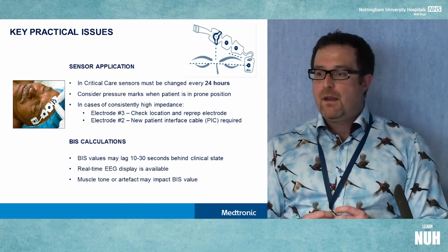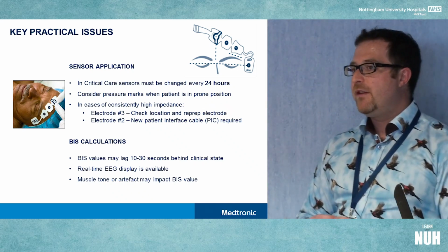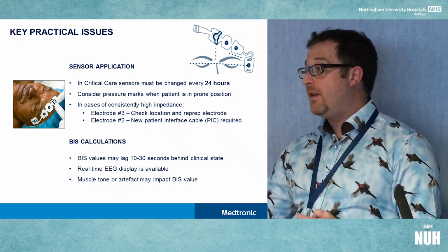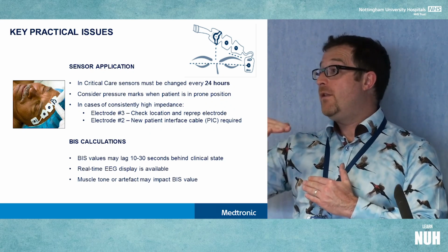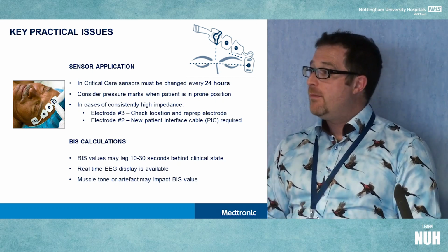So again, high level artifact or muscle tone we're aware of in terms of the fact that it may or may not be clinical. Sometimes we can get this higher level electrical noise that could be diathermy or it could be environmental. It's non-clinical, but it could give us a false positive in the BIS. So again, we're always interpreting that.